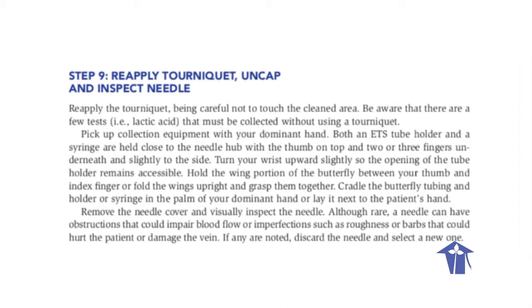Remove the needle cover and visually inspect the needle. Although rare, a needle can have obstructions that could impair blood flow, or imperfections such as roughness or barbs that could hurt the patient or damage the vein. If any are noted, discard the needle and select a new one.